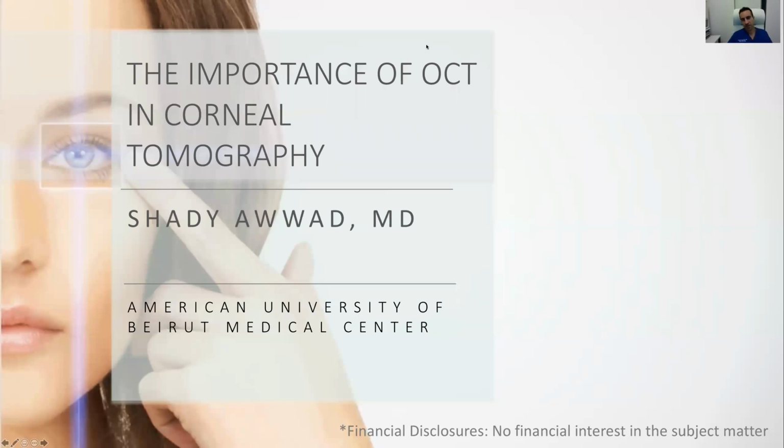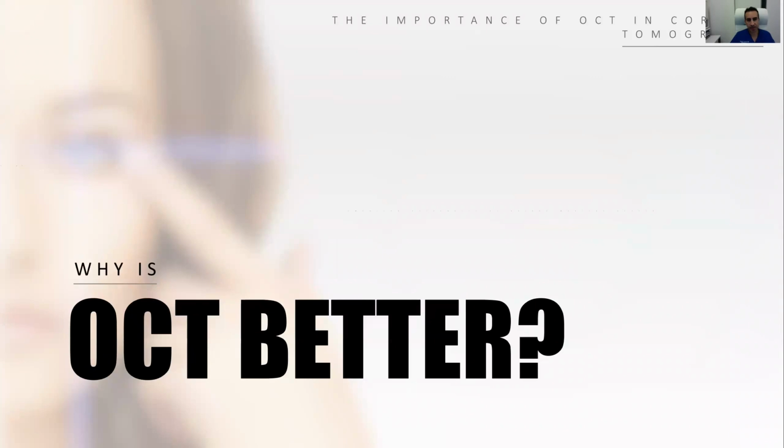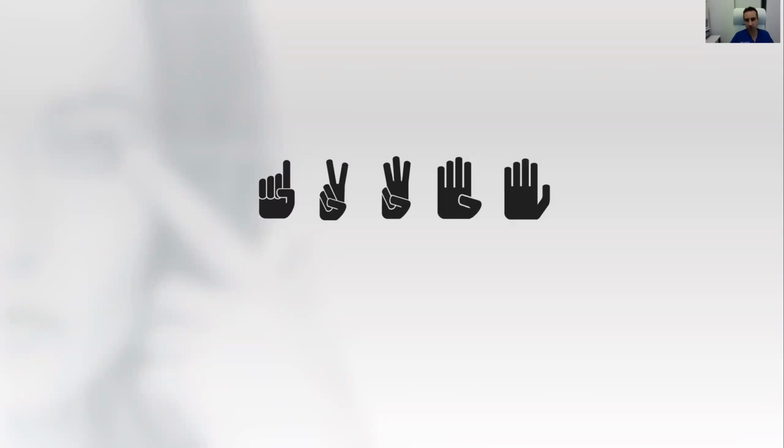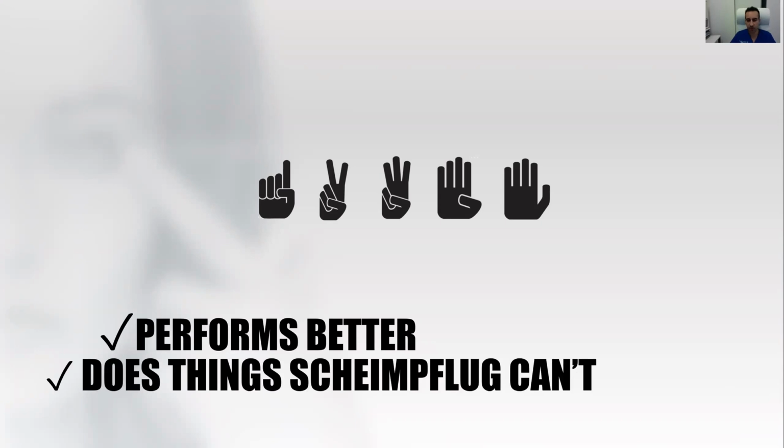Hello, everybody. What is the importance of OCT in your daily routine corneal tomography? Well, in my mind, OCT is better. And this is not just due to one factor, 2, 3, or 4, but actually I can name more than 5 reasons why OCT performs better and does things that Scheimpflug cannot.